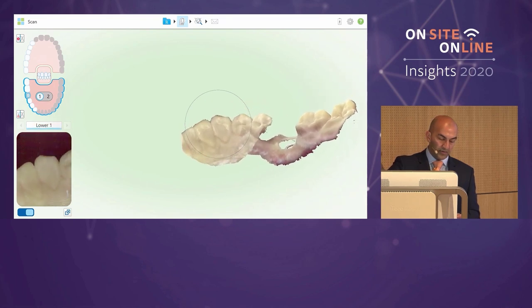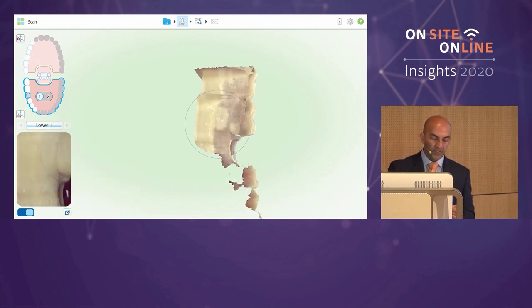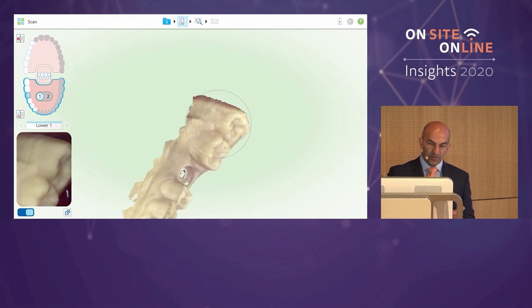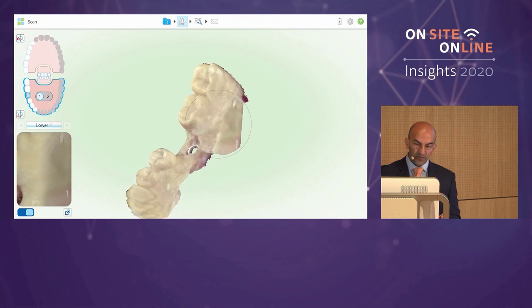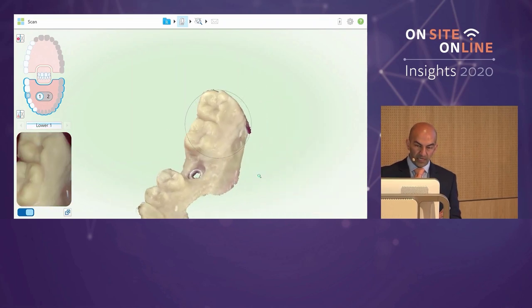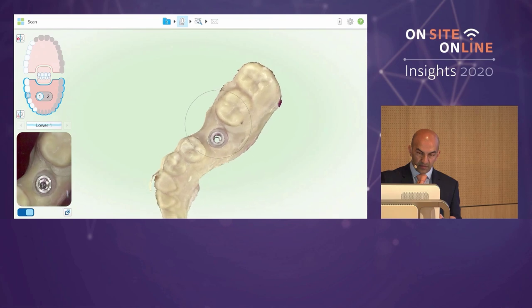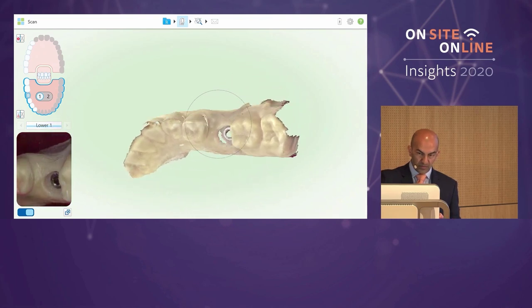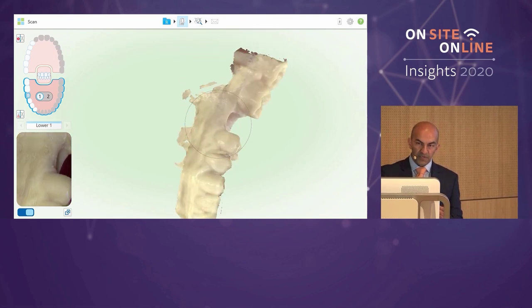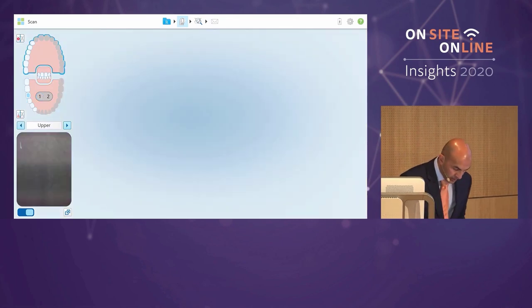Each different scanner has a slightly different protocol for scanning an implant case, so it's really important to pay attention to their scanning protocol whether for lab or chairside work. You follow that properly to make your life easier. We've done a scan of that quadrant — I've picked up the implant site, and it's important to pick up the adjacent teeth for contact information. I rotate the scanner in different directions to ensure the iTero wand's light shines into all the areas I need to capture.